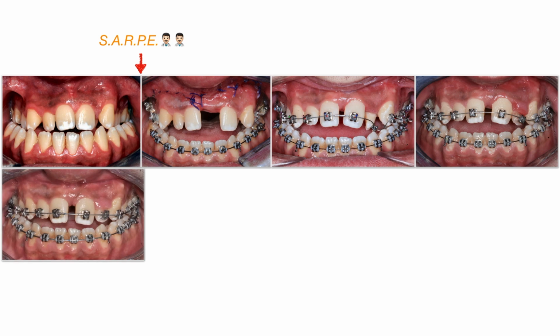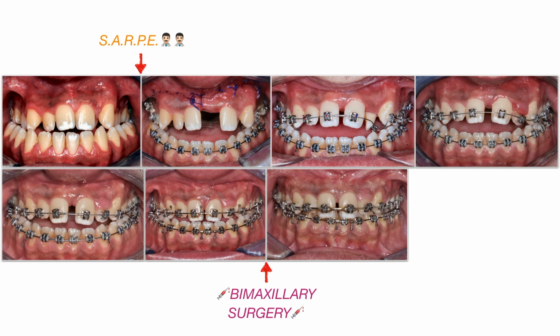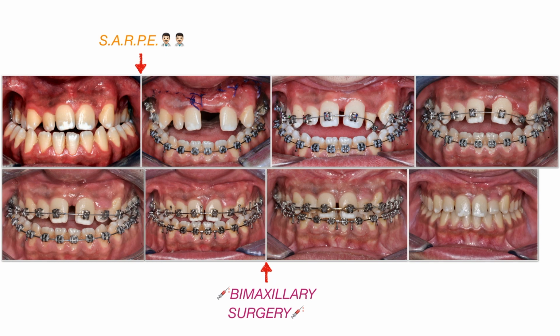Take a look at the sequential position of the canines. Even though the palate has been sectioned, they get additional torque from the pressure of the expander. That torque returns to normal when we remove the expander and settle after a few months. The real bone expansion we got here was no more than half the initial expansion. After the surgery, the negative overjet fades away and the new occlusion is settled in first class, which is pretty much it.